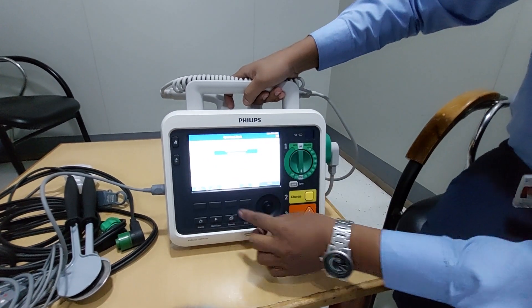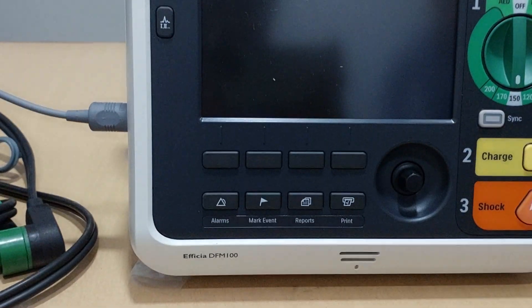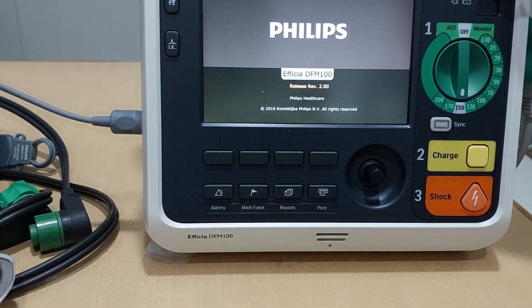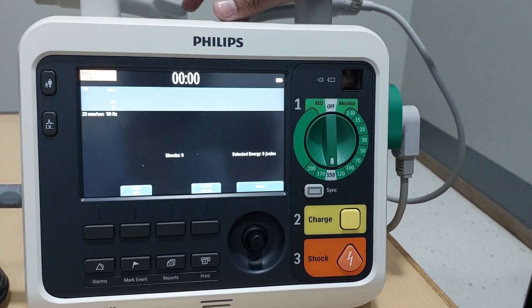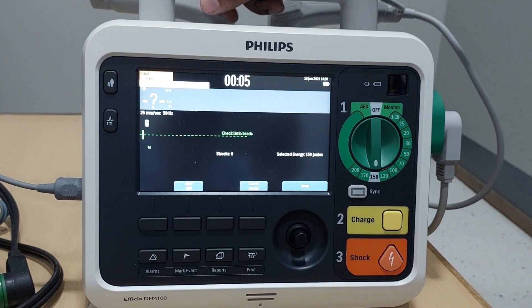After completion of the operational check, you have to press 'Exit Operational Check'. It will return to the main defibrillator screen. Sometimes what happens is there will be a cross mark displayed — that means the machine will not work and there is a fault inside the machine. At that time you have to check the basic settings and accessories of the machine; otherwise, call the biomedical department.